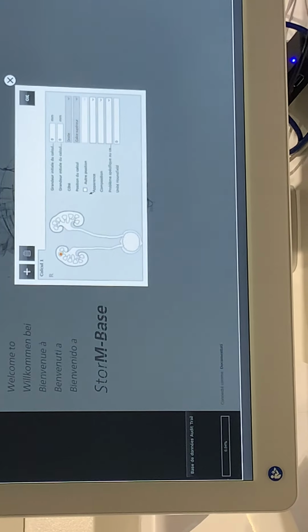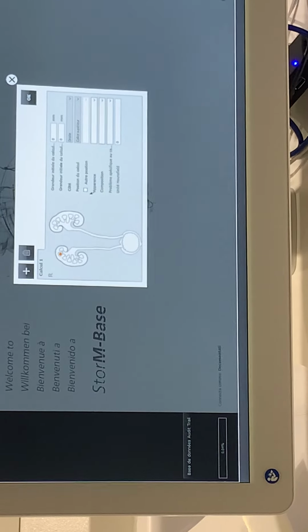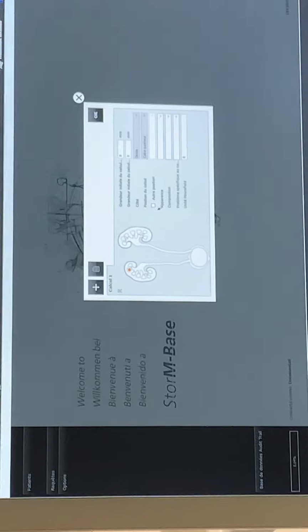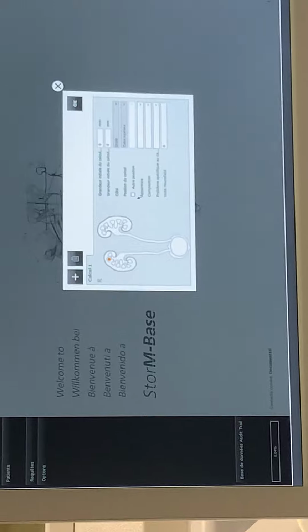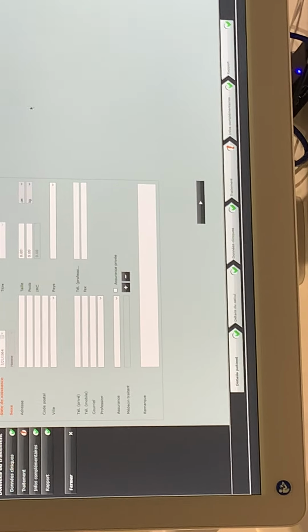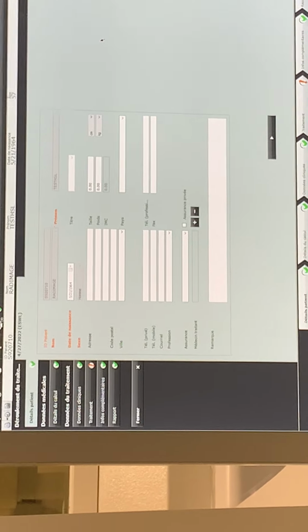First of all, it is asking for stone details. It is not asking for anything else, it is asking for stone details. I worked the last 2 days with Dr. Lieberman and we saw sometimes you do not know the stone details. It is completely no problem. If you do not know the stone details, we will press only OK. Now this is depending on the chart, not on the image per se. It's on the chart, because sometimes what is written in the chart is not what you see. But that doesn't matter.